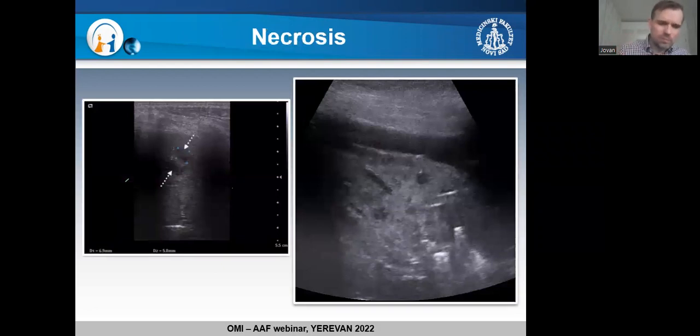One of probably the greatest advantages of lung ultrasound is this ability to detect even the smallest zones of necrosis, those hypoechogenic zones. Look at it. It's like 3, 4, or 5 millimeters, and there is no way that you will see those using chest X-rays. Even sometimes it's problematic on CT, but with chest X-rays, definitely there is no way that you can see it. And you told me that there are a lot of pediatricians now listening, and you know how important this is for treatment of those patients.